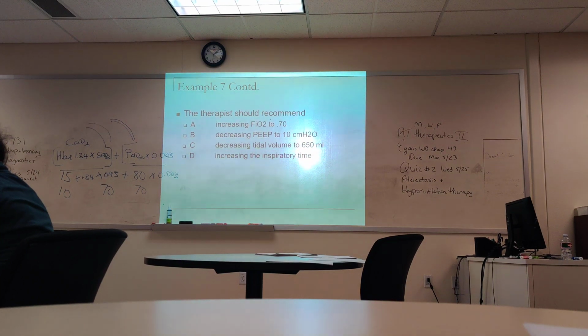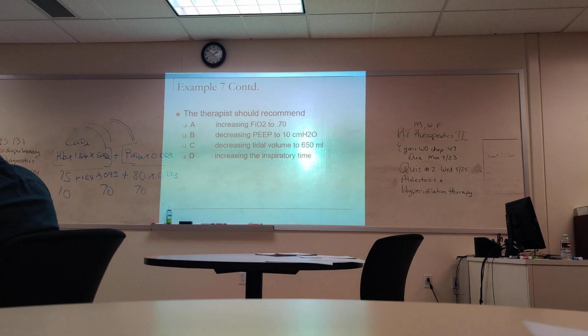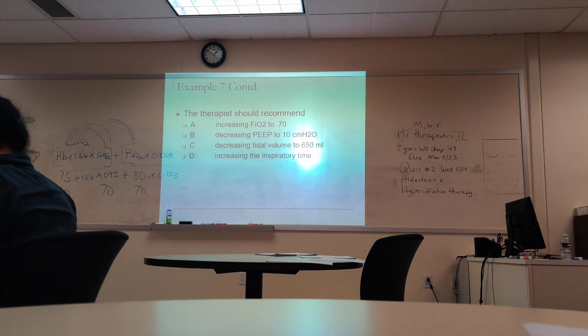So how do we give them more oxygen? What option there will give the patient more oxygen? Come on, guys. D? No, not quite. How about increasing the FiO2 to 70? That's the only choice you got.